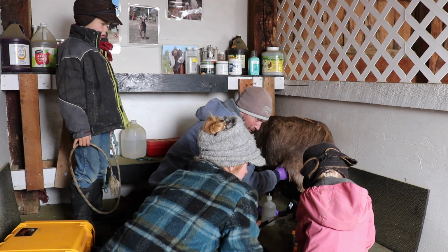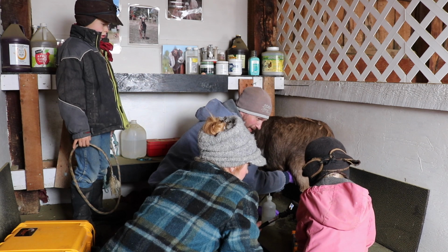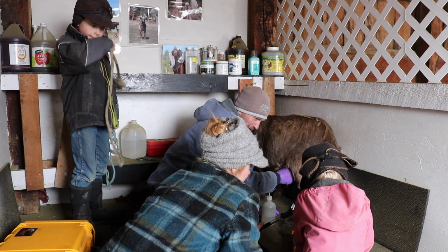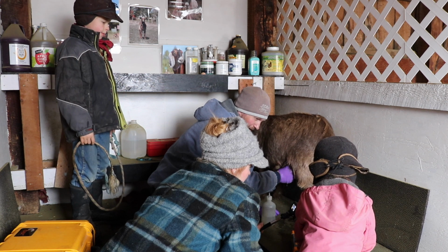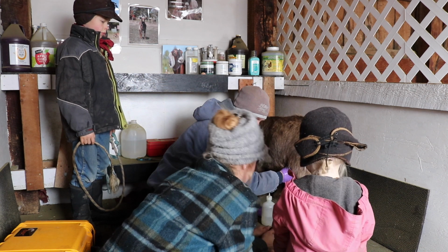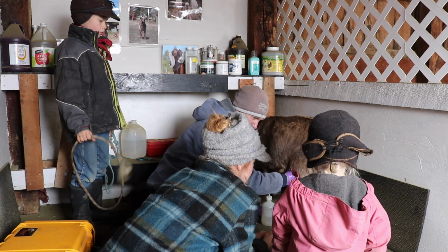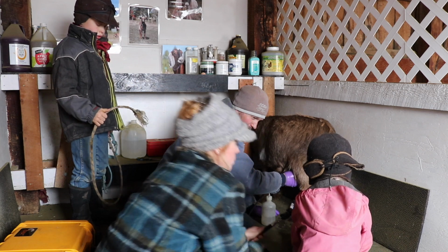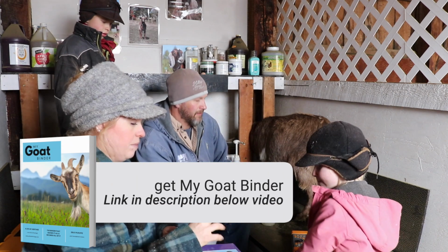They're going to be really tough to count. If you wanted to really get after this, we'd shave a patch, hold them down on their side, and then you could probably do a pretty good job of counting them at this point. I don't know how important that is. No, I don't think it probably is. It's kind of fun to know, but really it's just knowing she's bred.